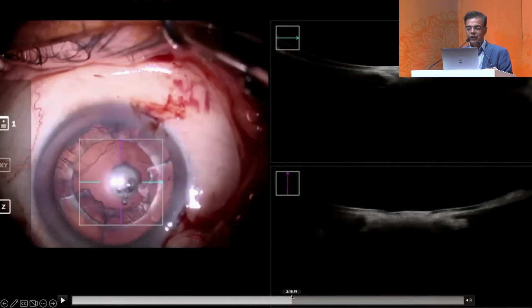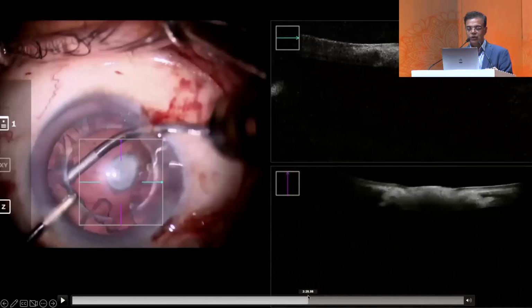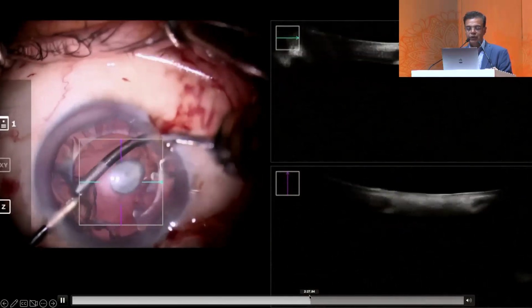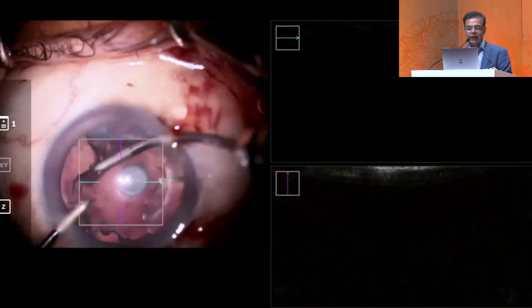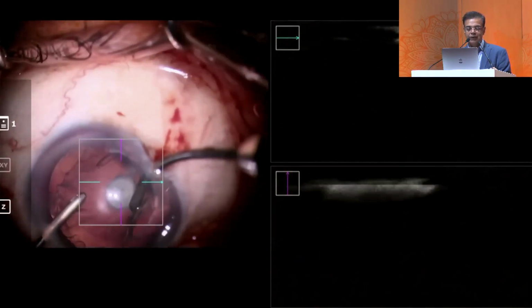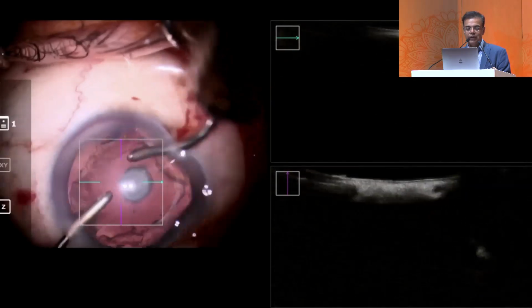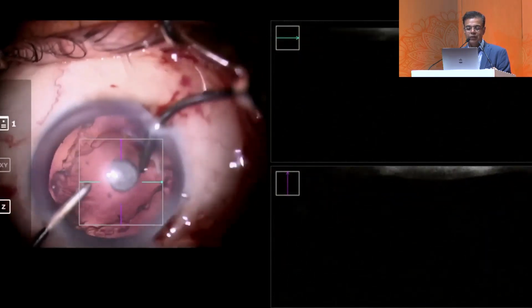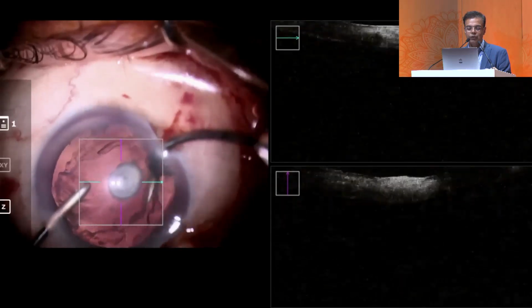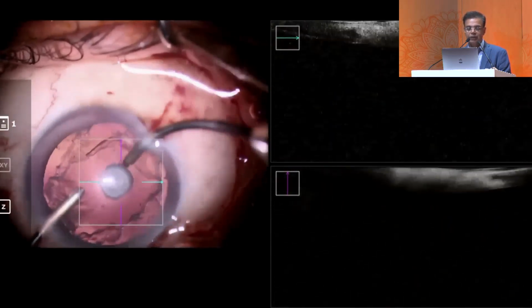And once you're done, you can again do intraoperative OCT and see what the situation is, how strongly adherent it is. And here I would then also try to disengage all the cortex from the equator of the bag and ensure that it is nicely separated out before I attack the small segment of the posterior pole. And I'm now going to leave just a small rim of cortex all around that posterior pole, and then I'll do either a viscoflotation or a hydroflotation of that attachment of the posterior pole.